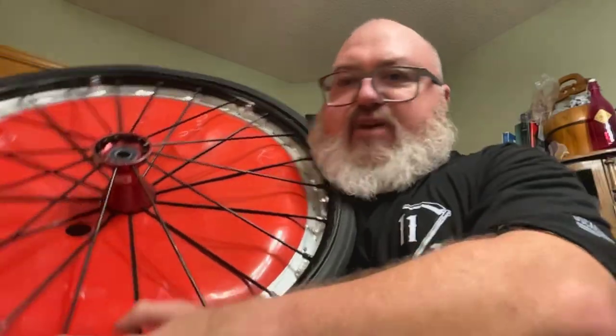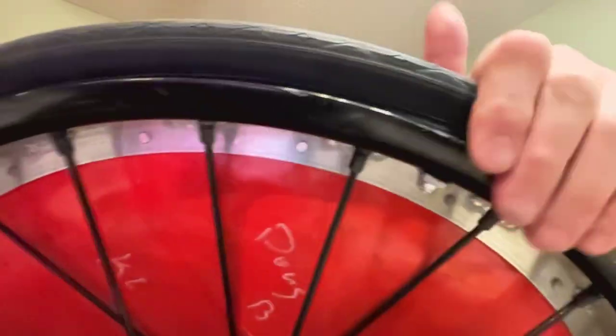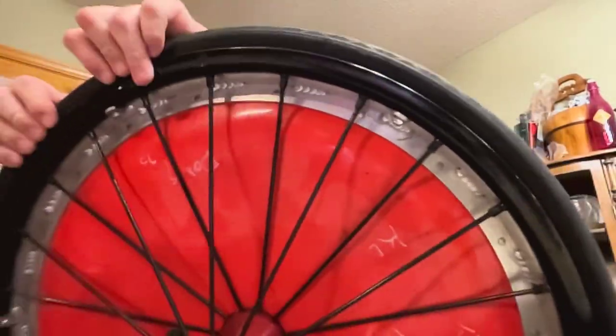So, valve stem is right here. I start here. I roll it over. Do you guys see what I'm doing? If you can't, I'm sorry. But I start kind of rolling over the tire onto the rim. So the rim has a little bevel to it. And I'm just making sure that is all the way on. Boom. And then I work on this side. And so I just kind of work it all the way over.